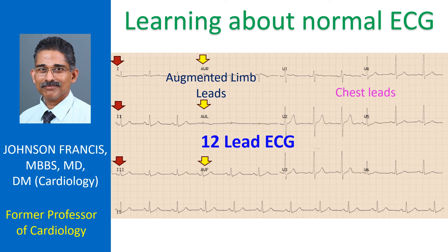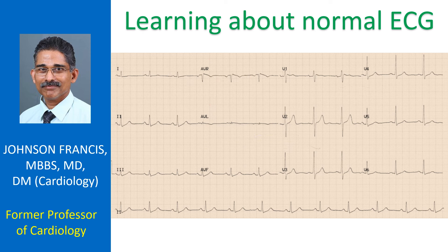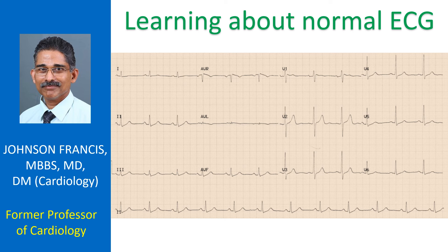All 12 leads have recorded ECG of 3 cardiac complexes in this tracing. There is a long lead 2 recording at the bottom of the tracing, which is a rhythm strip enabling better assessment of the cardiac rhythm. 12 leads can be acquired simultaneously and printed sequentially as in a 12-channel machine, or can be acquired sequentially as in a single-channel ECG machine.